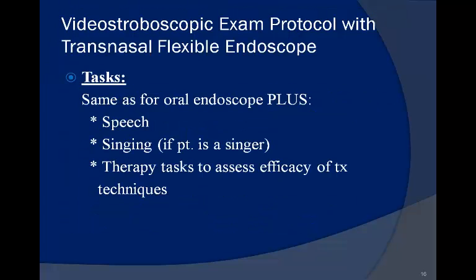When using a transnasal flexible endoscope for video stroboscopic examination, we use the same task protocol as for the rigid oral scope, plus we ask the patient to talk and count, etc. If the patient is a singer, we will always have them sing. With a flexible scope, we can even administer therapy probes to see if specific therapy techniques will be beneficial.